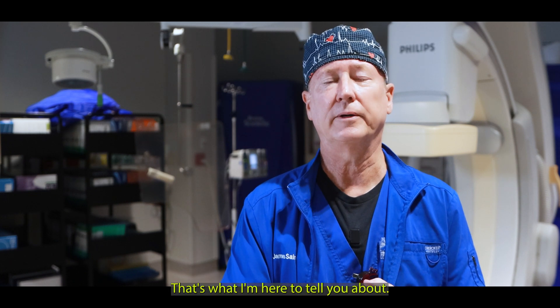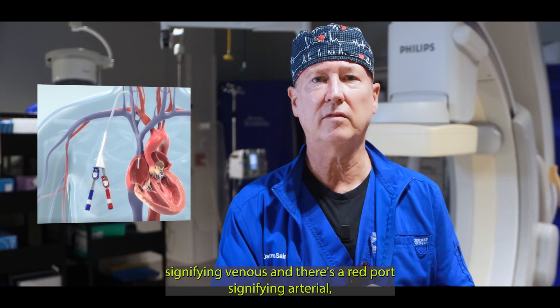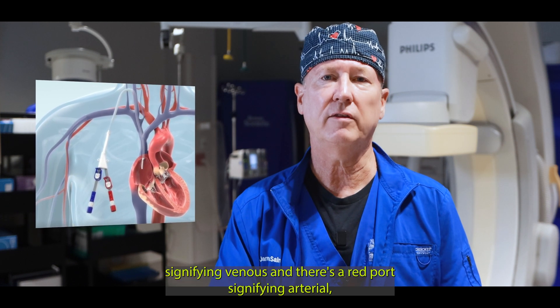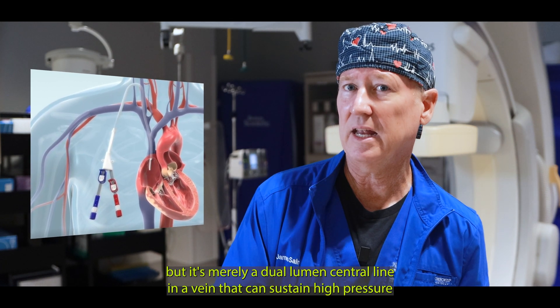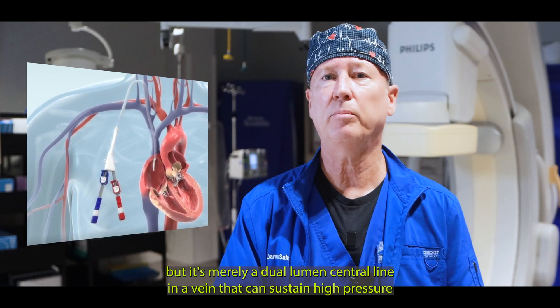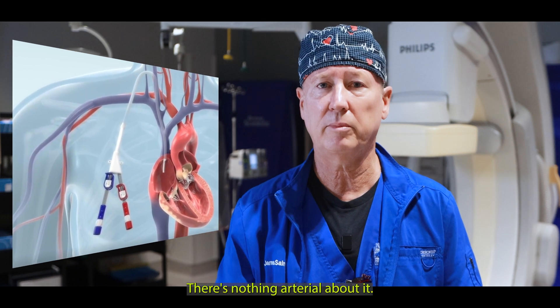And that's what I'm here to tell you about. When you look at it, yes, there's one port that's blue signifying venous and there's a red port signifying arterial, but it's merely a dual lumen central line in a vein that can sustain high pressures like when blood is being removed and returned with a dialysis machine. There's nothing arterial about it.